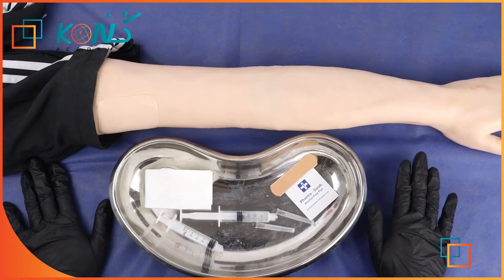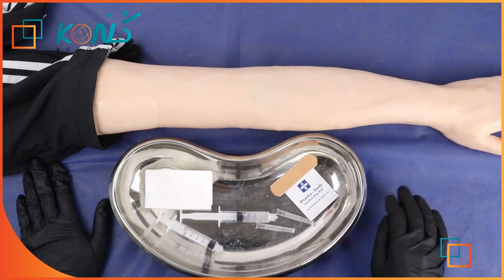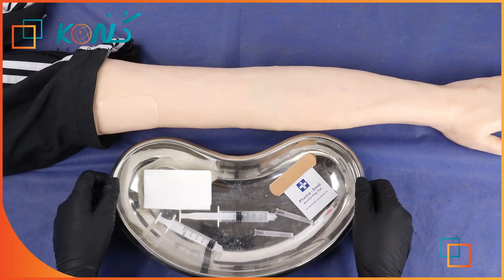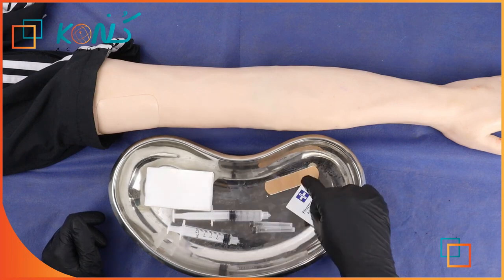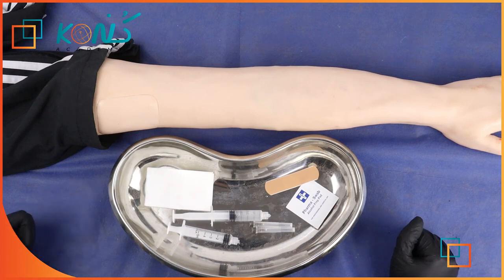Okay, in the exam, you will have a hand mannequin, and you need to teach your colleague how to give subcutaneous injection. In the beginning, you will wear gloves and prepare your equipment. You need 2 needles, syringe, the medication, swab, and cotton and plaster. In the beginning, you need to make sure that you are giving the right medication to the right patient with the right route and at the right time. Then you need to explain to the patient what you are going to do.